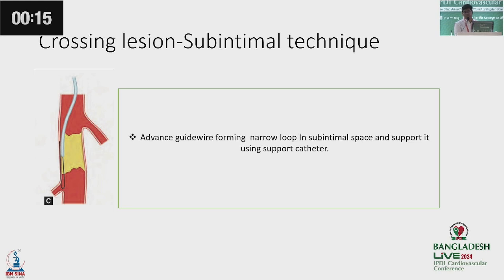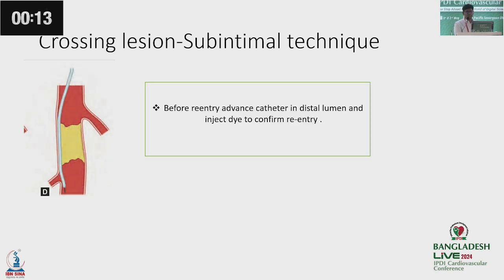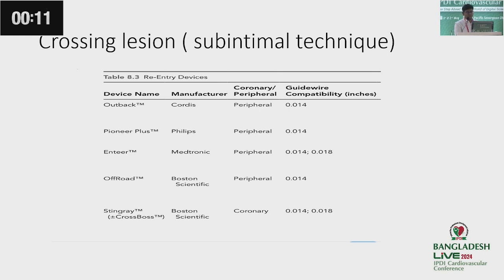And for this subintimal technique, there are some re-entry devices available in the field. I think there is Outback from Cordis, Enteer from Medtronic, and Off-Road from Boston Scientific.